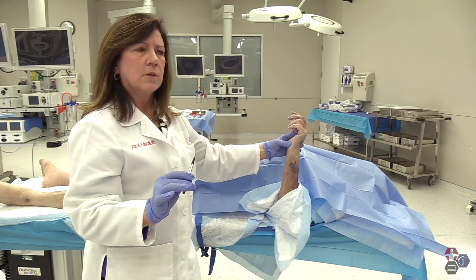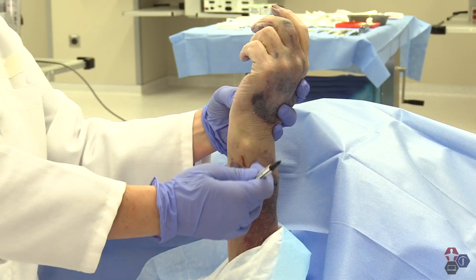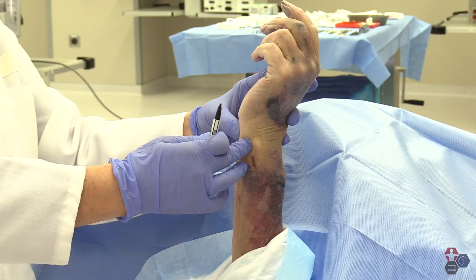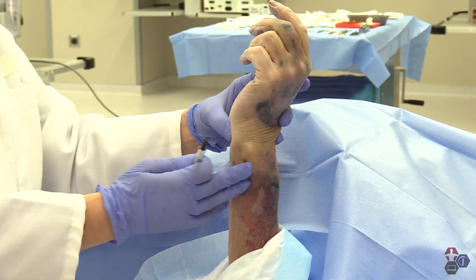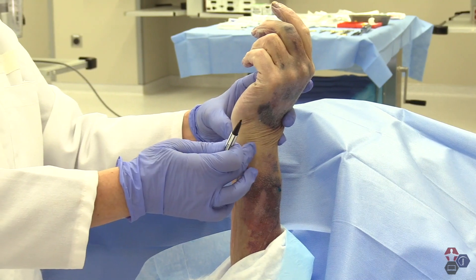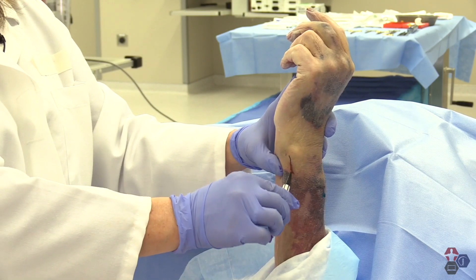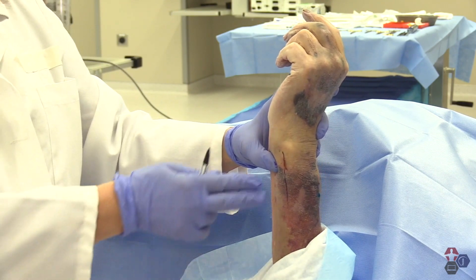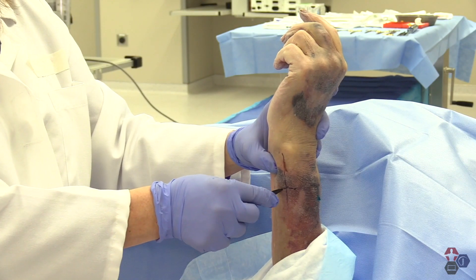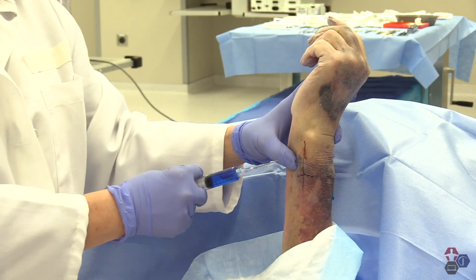The second nerve in the wrist and hand is the ulnar nerve. As you can imagine, it lies on the ulnar side of the wrist and runs with the ulnar artery — so it's not dorsal, it's more palmar towards the flexion compartment. My landmark is the ulnar styloid and the ulnar artery, and my nerve trunk lies right in there. I'm going to go two finger breadths above my ulnar styloid and lay down that trunk right across that area where I think that ulnar trunk is most likely to lie.